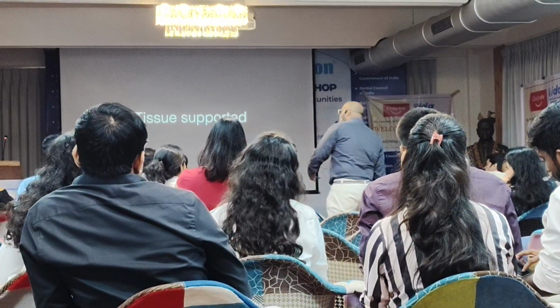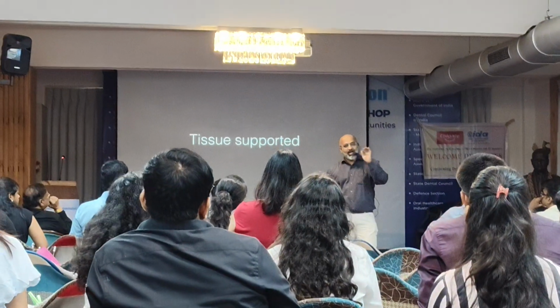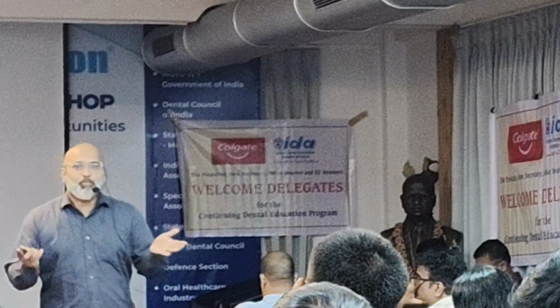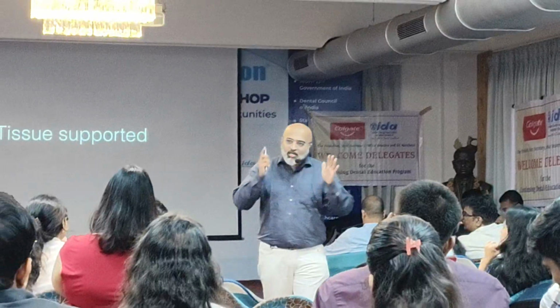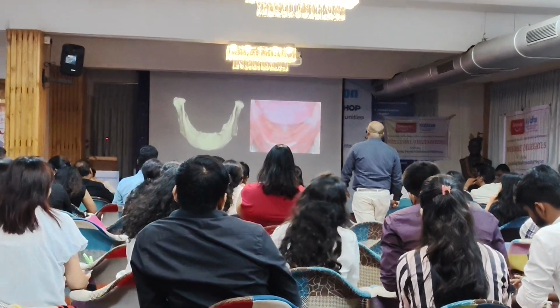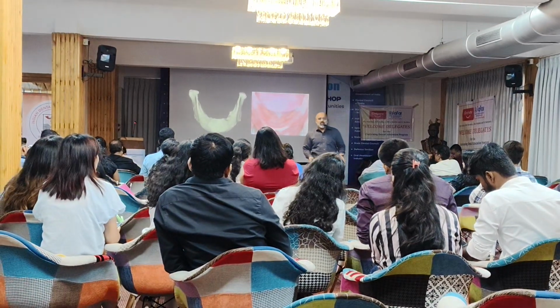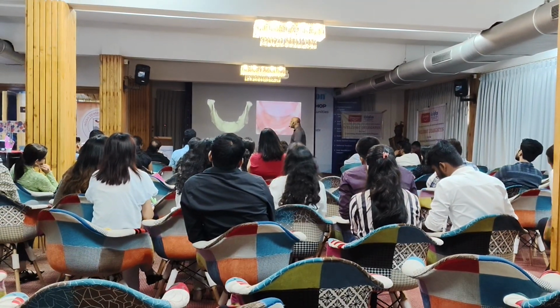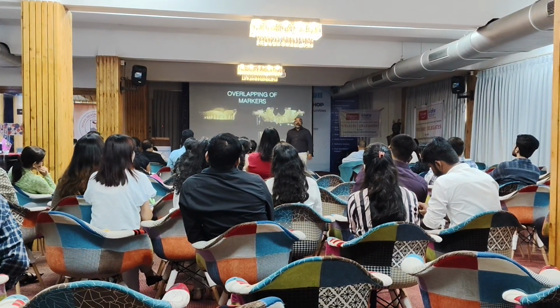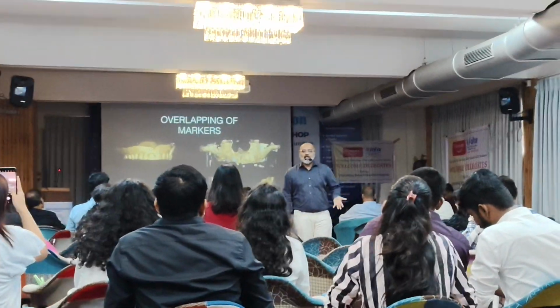So how to prepare a case for a digital implant before even making an implant placement is important. I'm going to tell you how to make a tissue supported guide for an edentulous case, and this is a workflow protocol which you guys need to follow. So I have a case like this, which is edentulous, bare bone. Do I know where I am going to place my implants prosthetically? No, right? So what I have to do is fabricate a denture and place markers on top of that. Why do I have to place the markers?